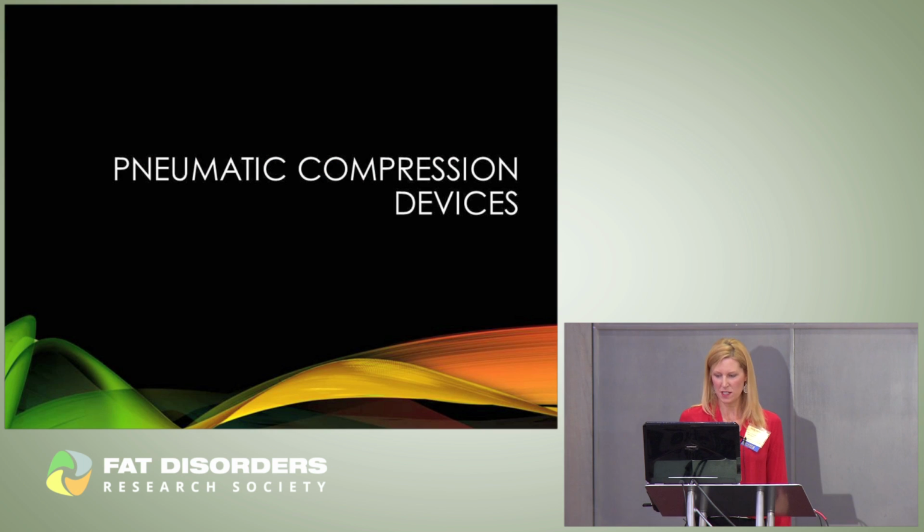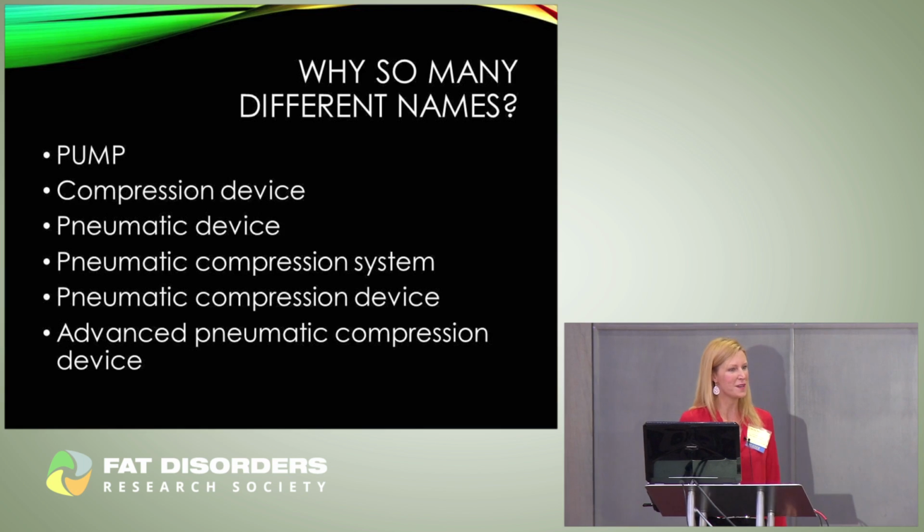So pneumatic compression devices, why do they have so many names? They're referred to as pumps, compression devices, pneumatic compression systems, pneumatic compression devices, and APCs as well. It can get a little confusing.